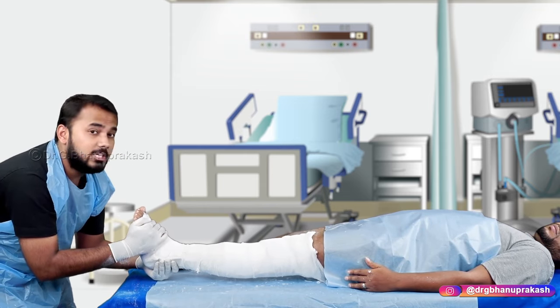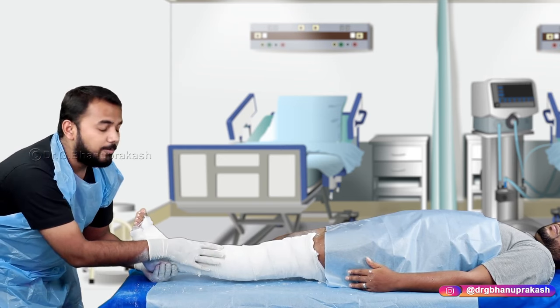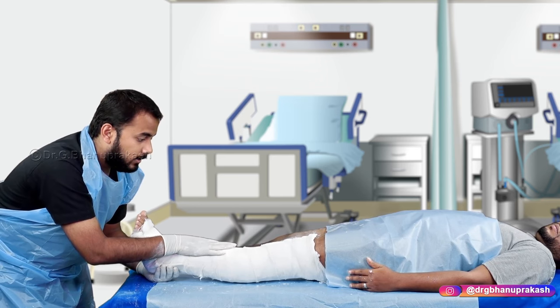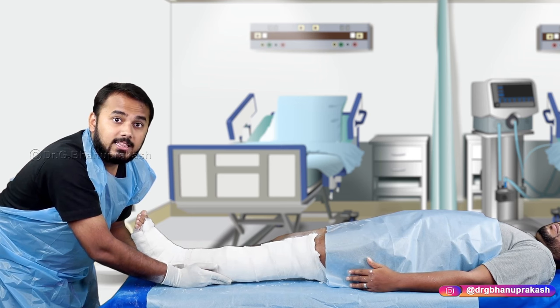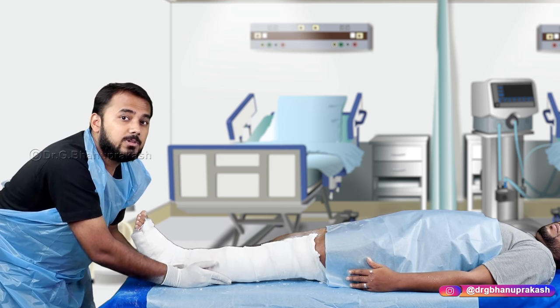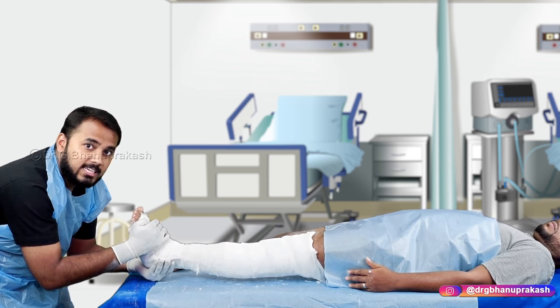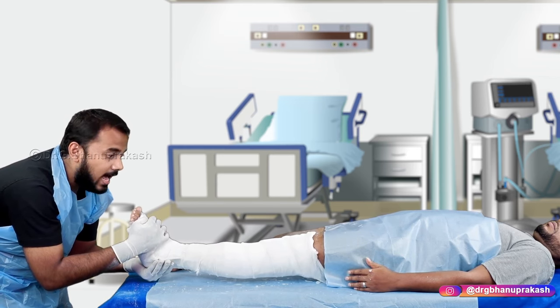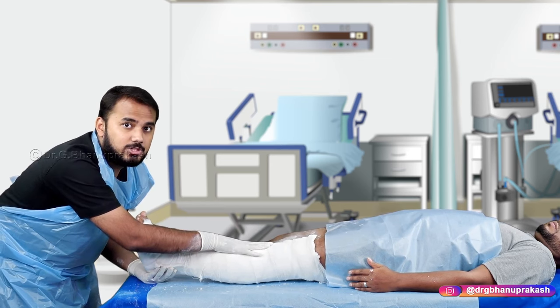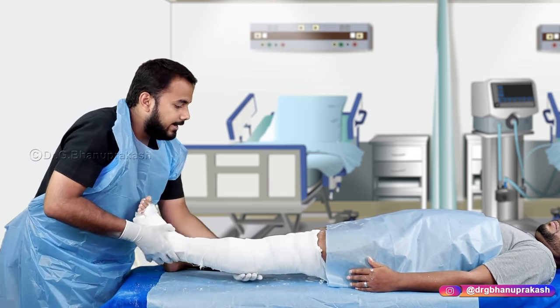Maintain this position for 3 to 9 minutes while the POP becomes semi-hard — this is called setting of Plaster of Paris. For the POP to become fully stiff and hard by completely losing water, it takes 24 to 72 hours — this is called hardening of Plaster of Paris. Keep the leg in position until setting occurs, then carefully leave the leg.